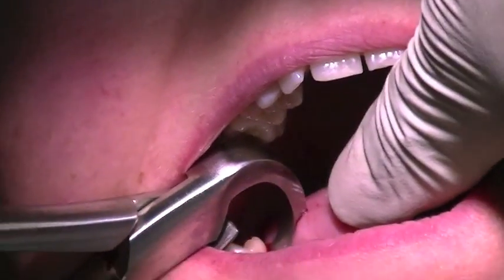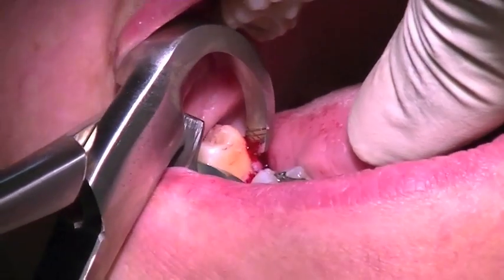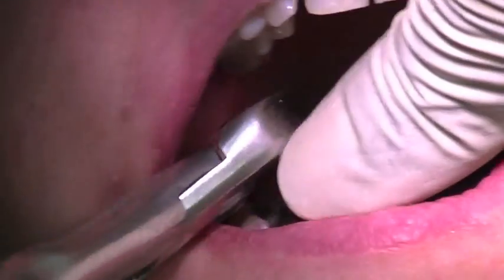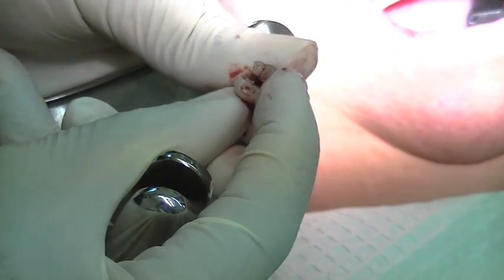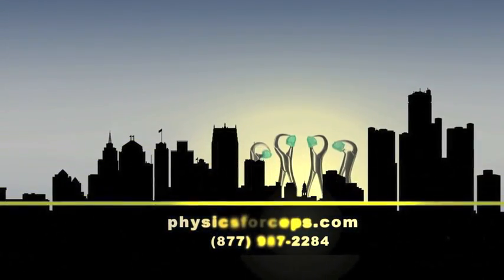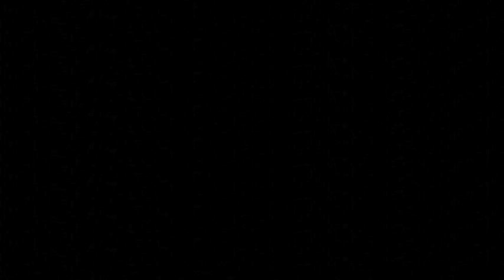Now I see the lower — yep, there it is, a single root. As you can see, a lot of buccal decay there all the way through.